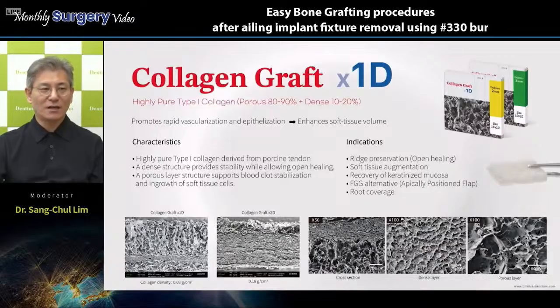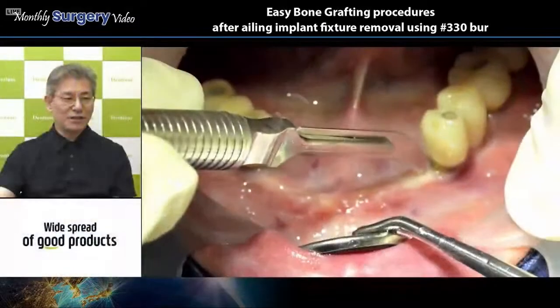Today, Dr. Chung may use this collagen graft combined with the hard collagen membrane. We are going to get the lessons and tips of the procedure. How can I deal with this collagen graft in a big GBR procedure? Okay, let's move to today's surgery.